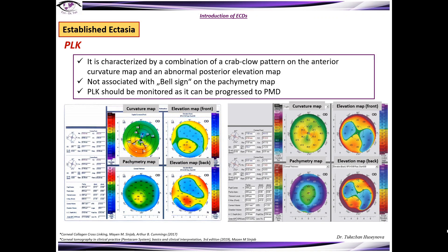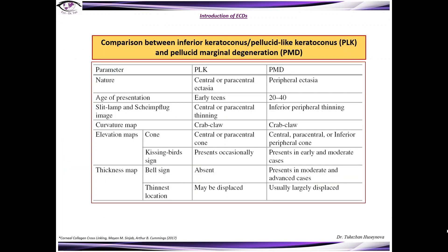PLK (pellucid-like keratoconus) is characterized by a combination of a crab-claw pattern on the anterior curvature map and an abnormal posterior elevation map with a kissing-birds pattern. There is no association with the bell sign on the pachymetry map, and PLK should be monitored as it can progress to PMD. This table summarizes the differentiation between PLK and PMD.